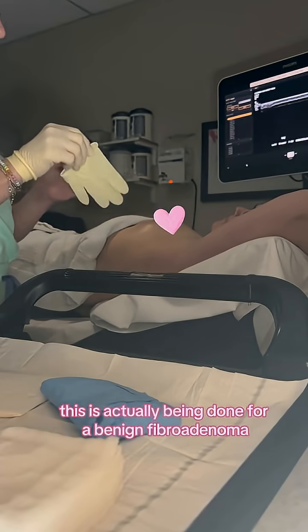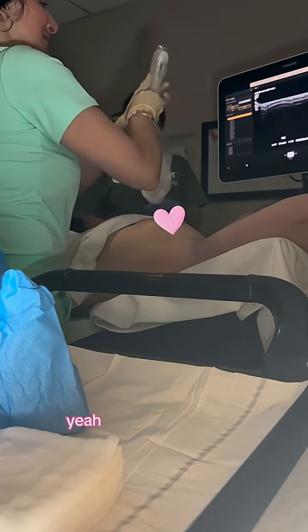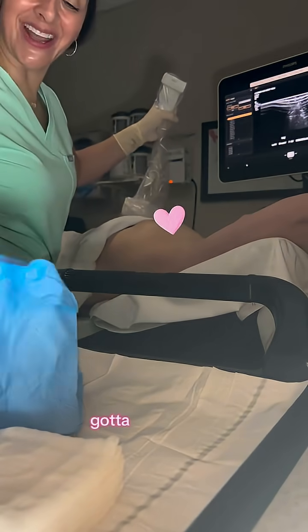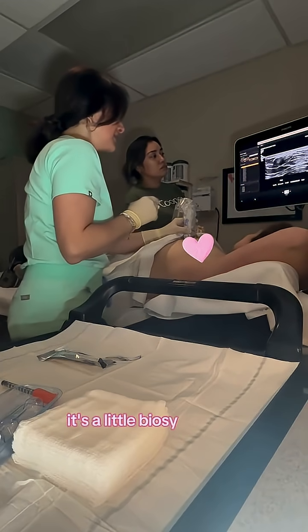This is actually being done for a benign fibroadenoma, but it's growing, so we want to take it out. First, I'm putting the probe cover on — I call it a probe condom. Got to get the lube on. There's the fibroadenoma that we're going to be taking out, and it has a little biopsy clip in there.